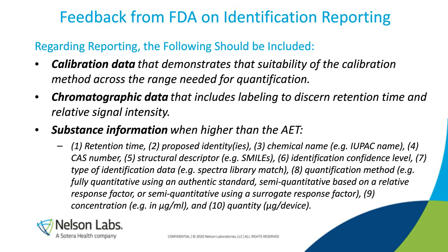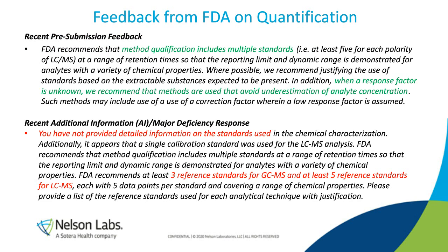as we can provide. Okay, so let's talk about some feedback that's a little bit more specific to quantification. And here I have some information that we see in feedback, like pre-sub feedback, and also in deficiency responses. So here they say the FDA recommends that method qualification includes multiple standards, for example, at least 5 for each polarity of LCMS over a range of retention times, so that the reporting limit and dynamic range is demonstrated for analytes with a variety of chemical properties.